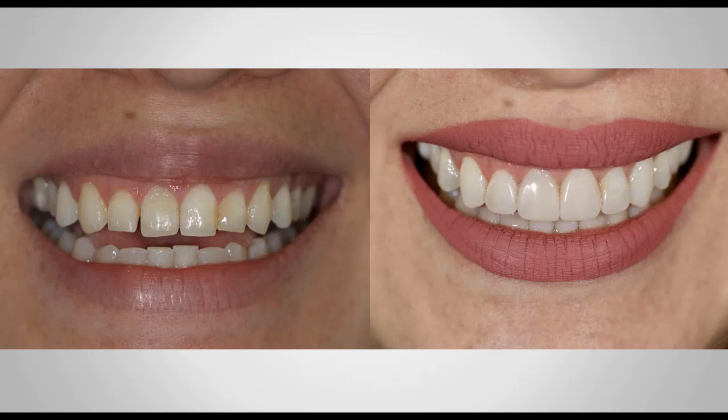And you can see the before and after photo. You can see how nicely and how well developed and pleasant these composite veneers are at this point. And this is my prototype fabricated with the flowable composite, following the steps that I'm almost ready to present to you. But most importantly, I want you to look at how nicely polished they are. Look at the gingival health that you may see.